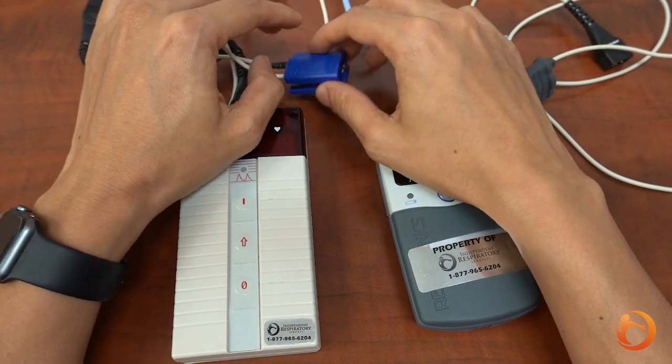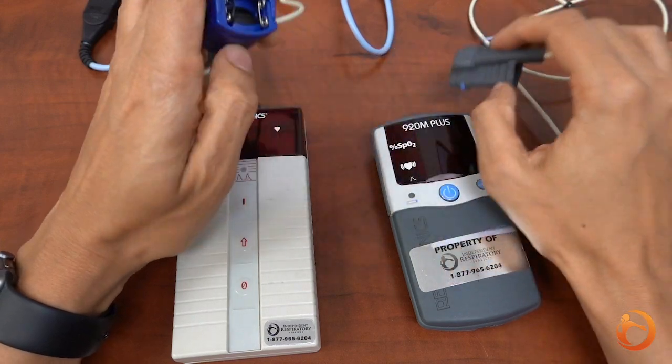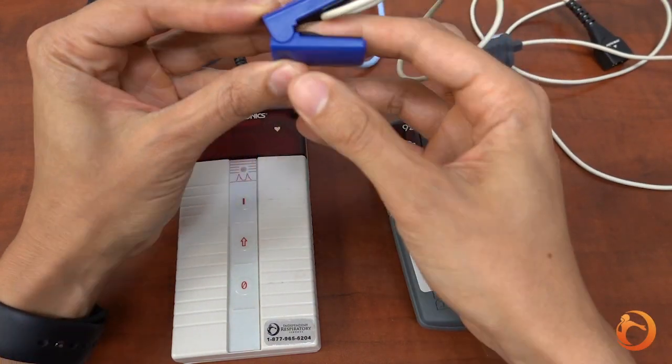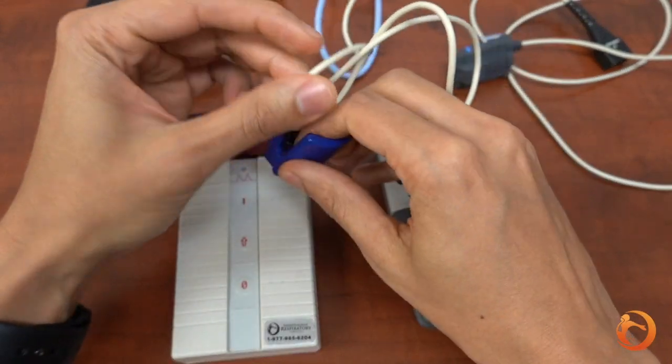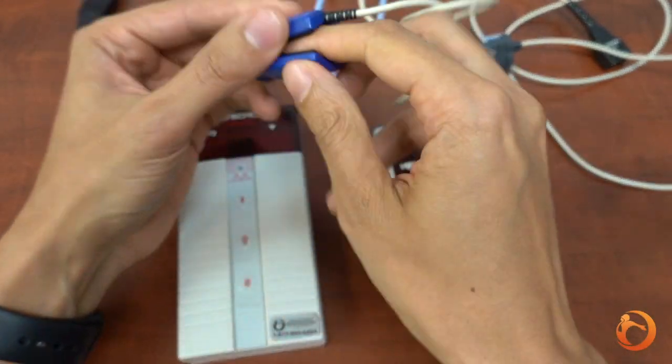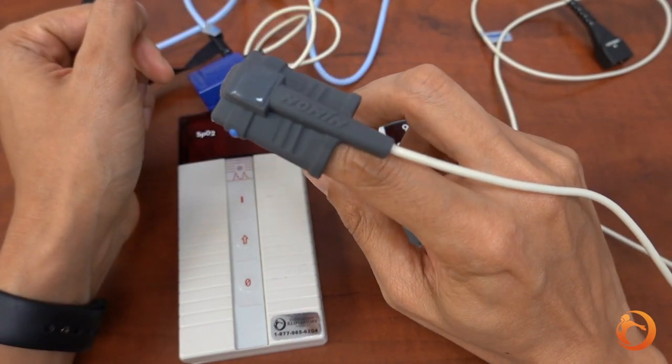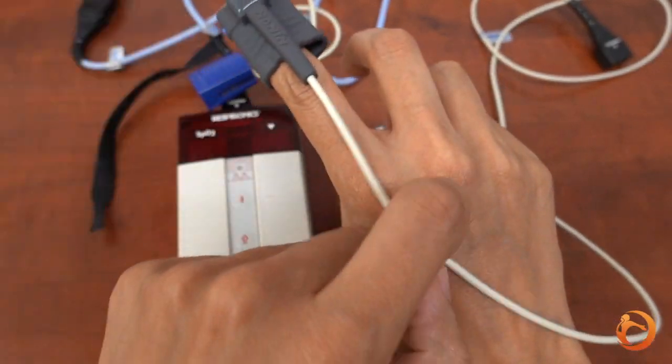The probe itself could be a clip or a rubber boot. If you were given a device with a blue clip, clip it on your finger with the cable on top of the finger. If you were given the grey rubber boot, then slide your finger in it, making sure that the cable will be on top of the finger.